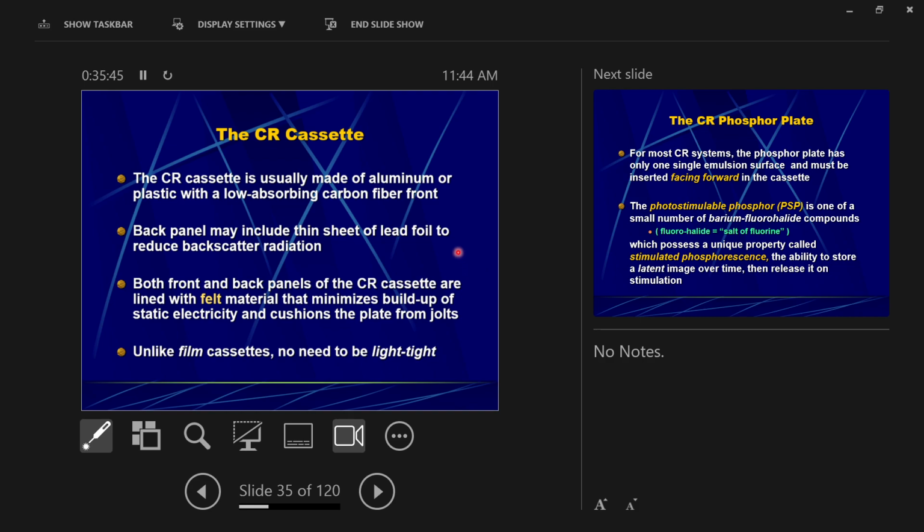And that was a huge part of the X-ray room, was our dark room, okay? It took up space. It has to have special light bulbs, special protocol for going in and out of it, making sure you're not in the middle of removing a piece of film and someone comes in like, hey, and opens the door and then ruins your exposure, right? There's all these things you have to consider. You have to have your chemicals, you have to be the right temperatures, your processor has to be checked every day. There's all these things that you have to think about with your darkroom. We don't have any of that anymore, okay, which is very nice. It's taken away, fortunately in this case, a lot of the extra thought involved in doing radiography, right? We have less work to do now, which is always nice.